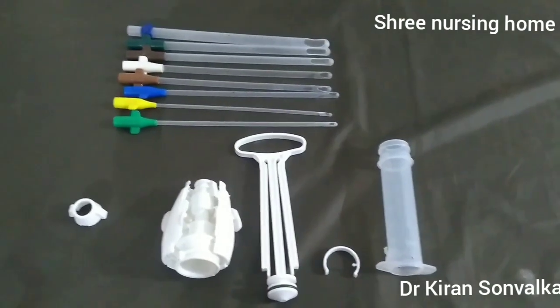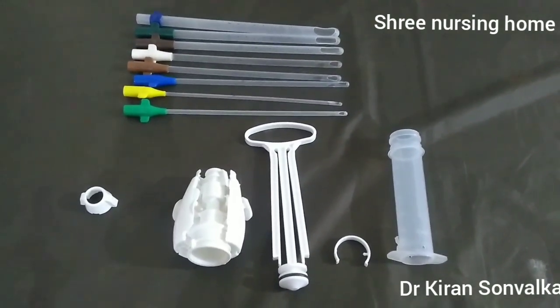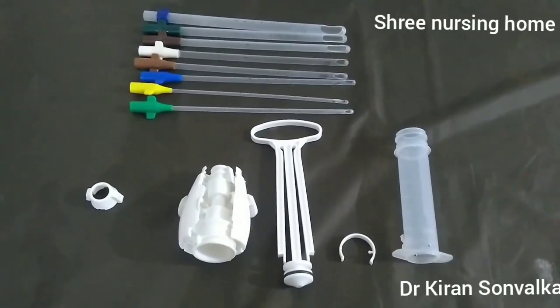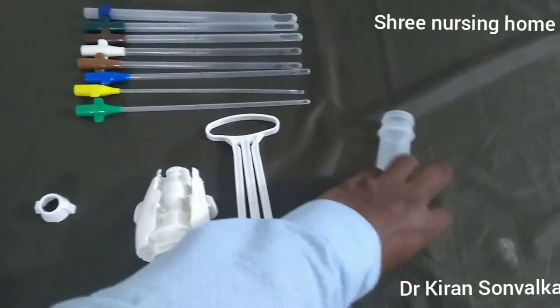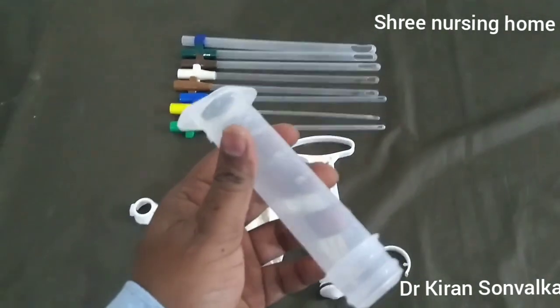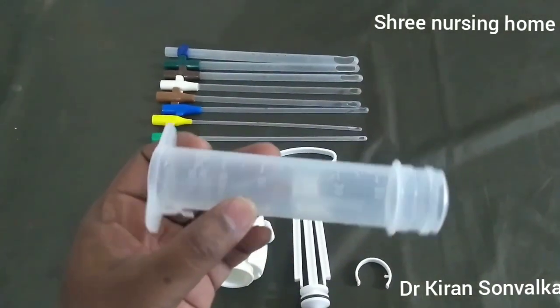Good morning. We are going to talk regarding MVA syringe — Manual Vacuum Aspiration syringe. These are the parts of the Manual Vacuum Aspiration syringe. The first one is the cylinder or barrel, which contains markings from 20 ml to 60 ml.